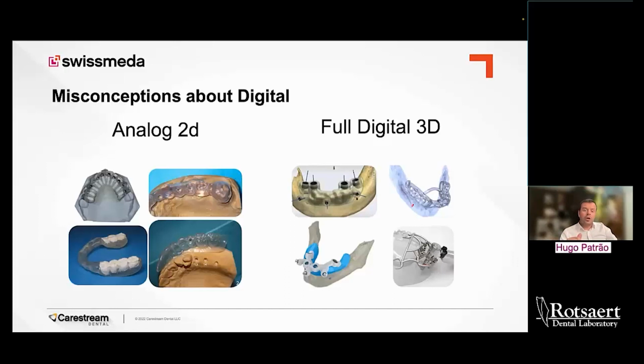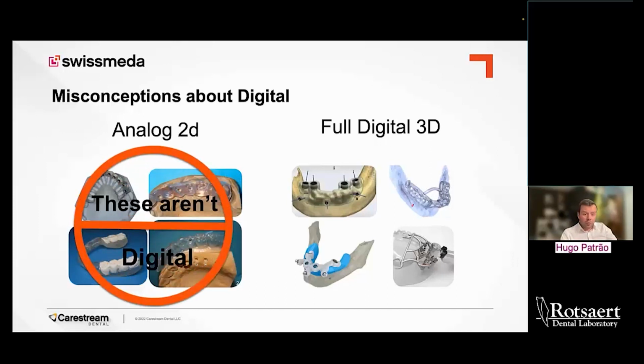Basically, those guides only tell you where the technician would like to place a crown and where your abutment needs to come out. So it doesn't take into consideration type of bone, or the osteotomy, or depressions, or defects, or even a funny root next to the implant. It's just an idea of where the abutment needs to come out. So to make it clear to everyone, those are not digital guides. Those are not implant guides. Those are temporary or restoration guides. So today, for the sake of accuracy and clarity, we will discuss full 3D guides.